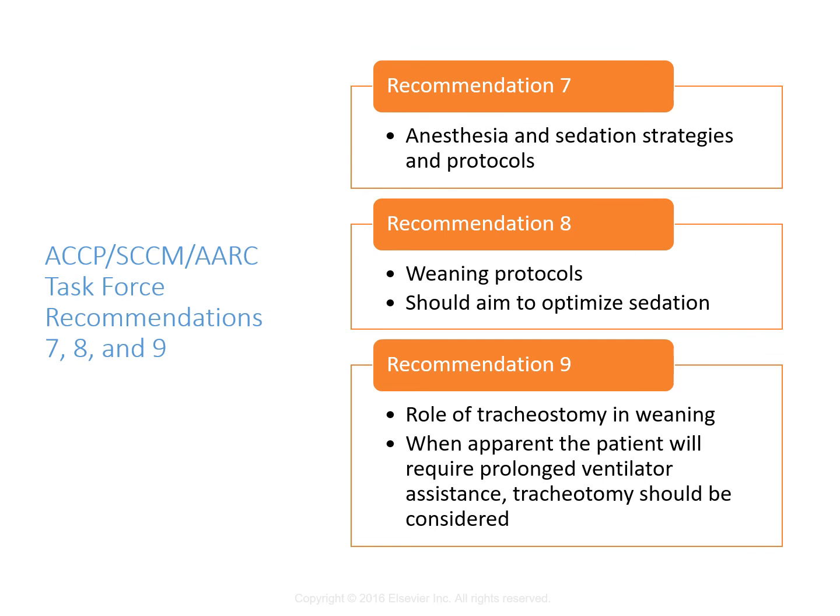do that. Sometimes they might have to go to a trach button if the stoma needs to stay open for secretions or other reasons. And that's just a little hollow tube that's inserted into the stoma, and it has some flanges, and it can be capped during the day and then taken off at night. So that's another way of doing a progressive wean from a trach if a patient needs it.